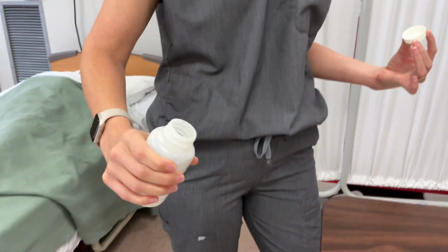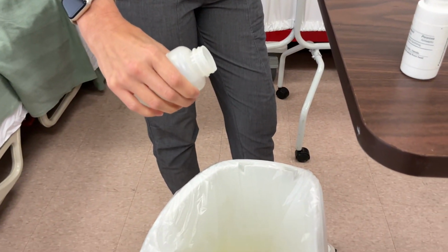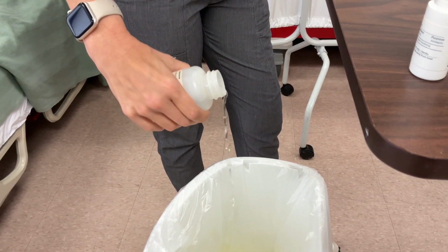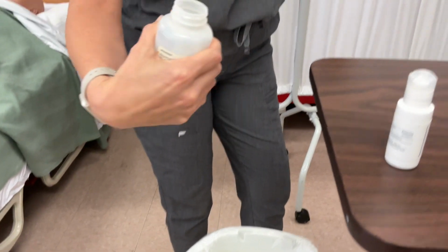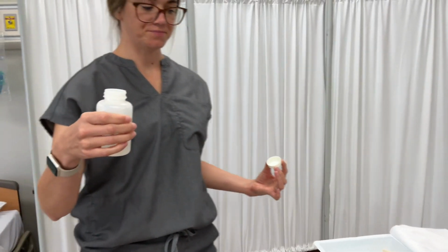Okay, so now I'm going to lip it one full turn. So we're just pouring a little bit of liquid out all the way around. All right, so we have lipped our solution.